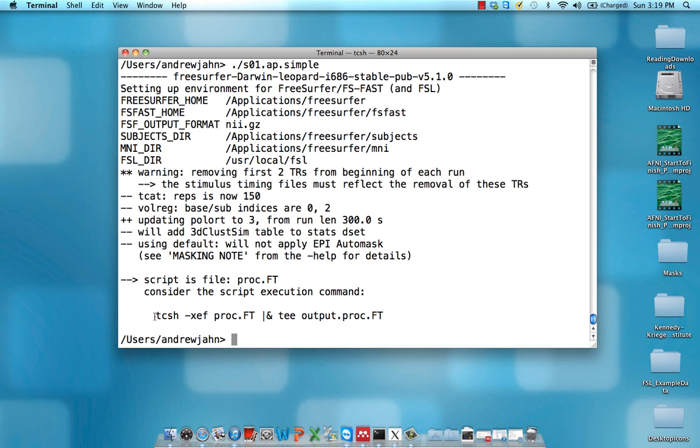Remember, we're using tcsh. In the first video, we talked about how to set that up as a default. And this -xef command or options, that means print everything to the terminal before running it, that's what the x means. E means terminate if there's any error, and f means don't run the startup tcsh script.